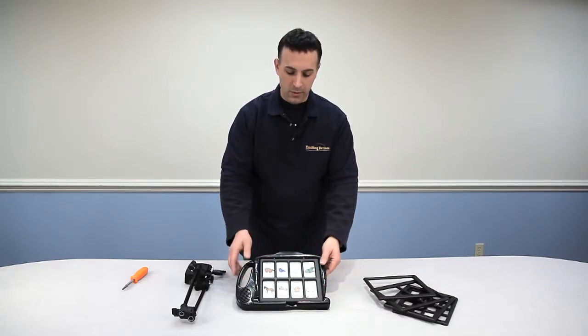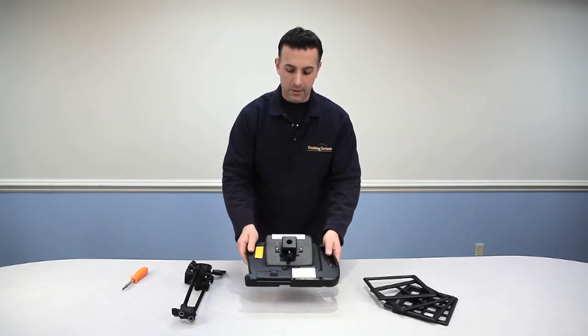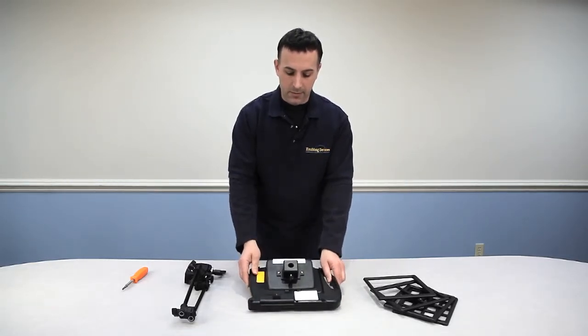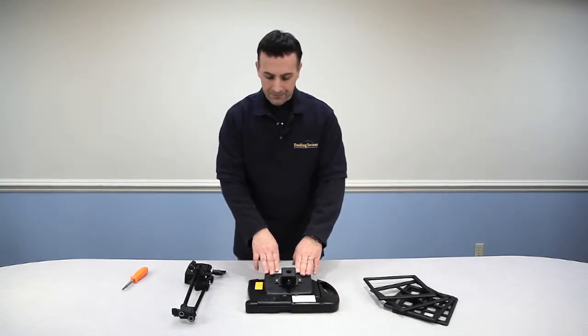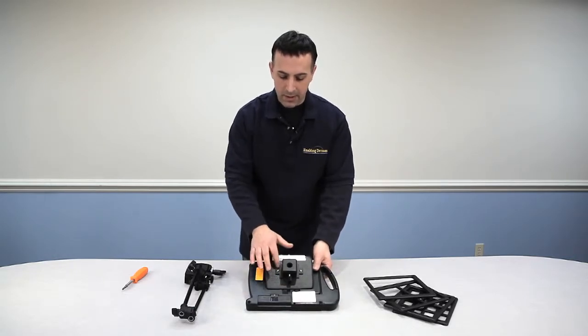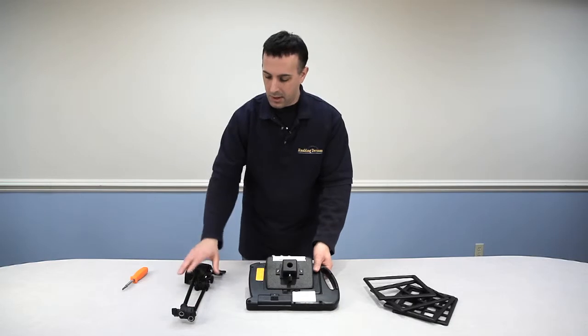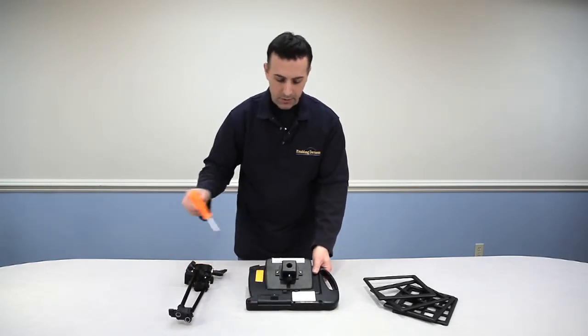I just want to show you this new feature we've added to our 7-Levels. We have a mounting system built into it, which a lot of customers have asked for, so we brought it in. The mounting system comes with the 7-Level, and a mounting bracket is attached on the back of the unit. You also get a mounting arm with a clamp.